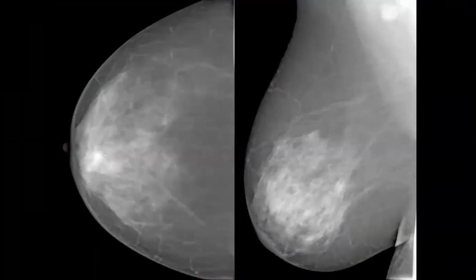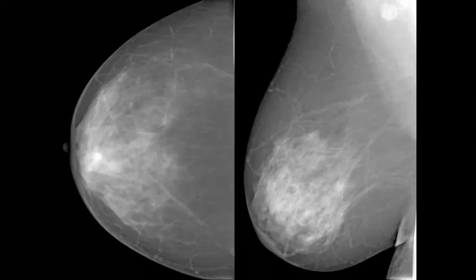What about this? Suhair, this case for you. Craniocaudal and the mediolateral oblique view showing global asymmetry. I see asymmetry at the craniocaudal view, retroareolar. Excellent. So I have to do compression, spot magnification view. Again, you have seen asymmetry, retroareolar area at craniocaudal view. What else? In the mediolateral oblique, there is an added density at the left axilla representing lymph node enlargement.